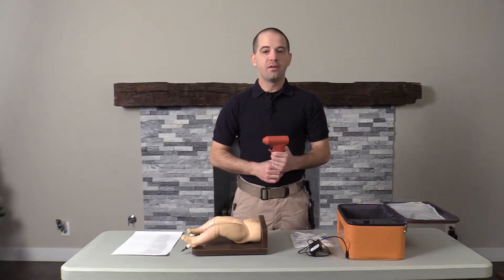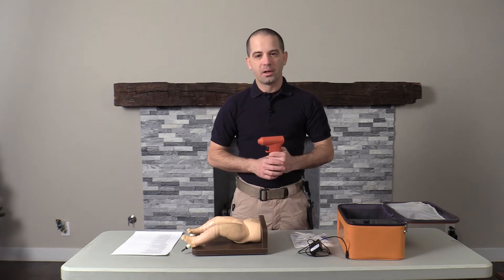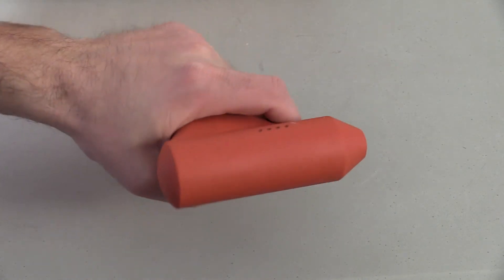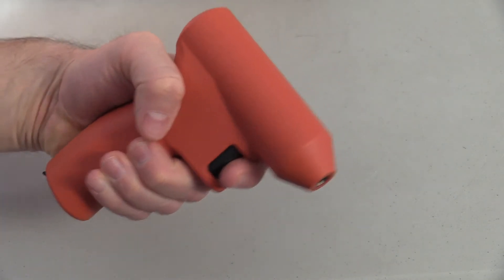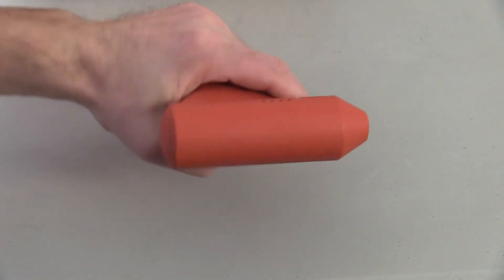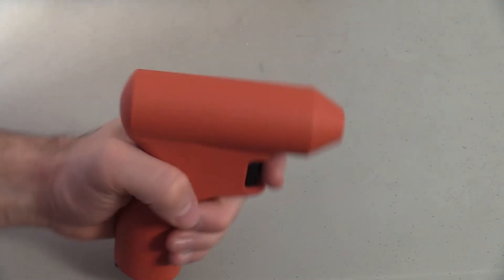What makes this gun different than the other I.O. drivers on the market? Well, first of all, they really took a look at the ergonomics. Ergonomically, it actually feels much more comfortable in the hand. Especially for individuals with larger hands, you're going to find this is much more comfortable to use when performing an I.O.